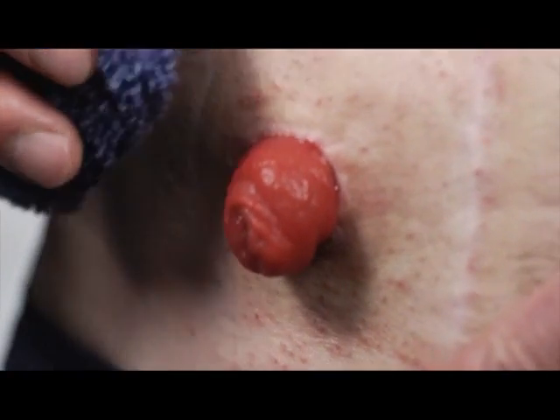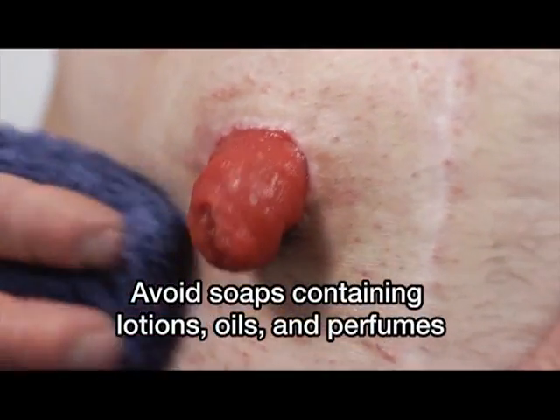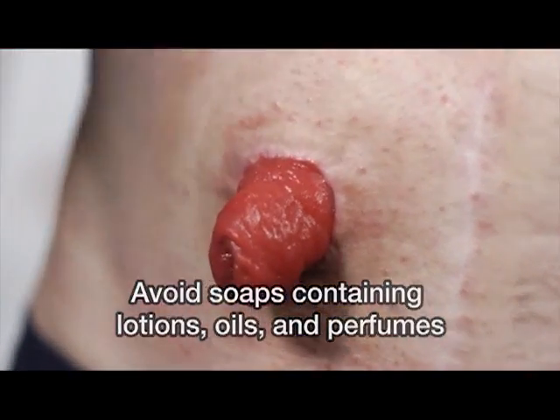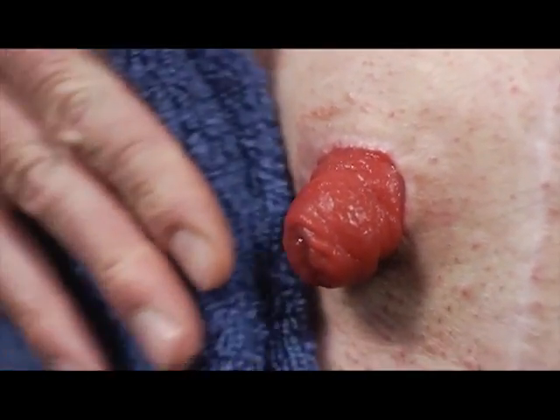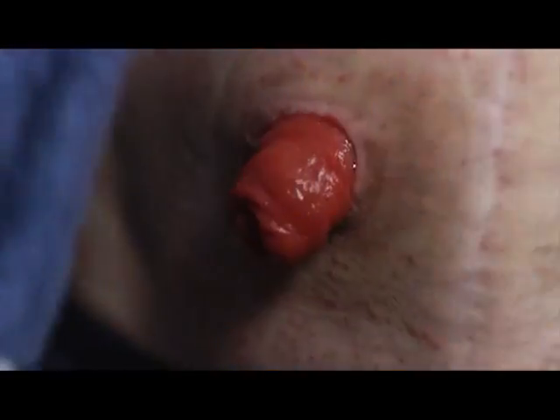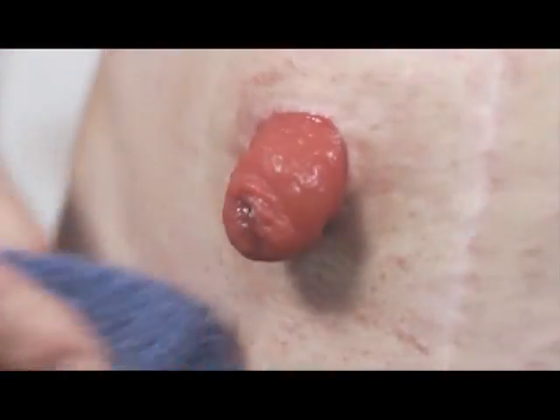Before applying a new ostomy skin wafer, it is important to wash your skin thoroughly with warm water. Don't worry, water will not hurt your stoma. After washing your stoma, make sure to dry your stoma well by patting a dry towel all around the stoma. Slight bleeding of the stoma is normal.